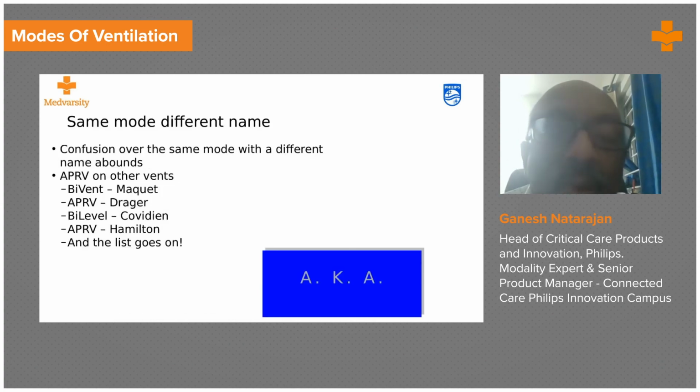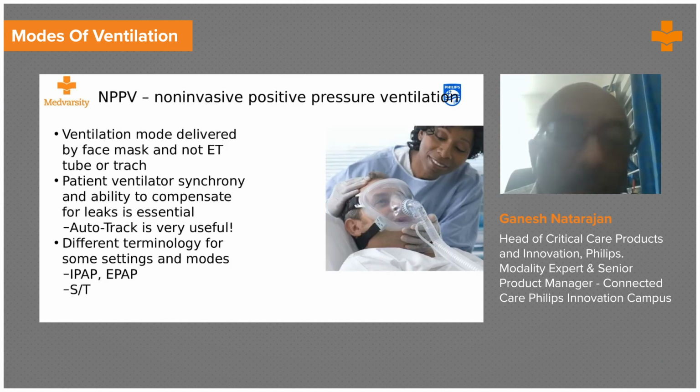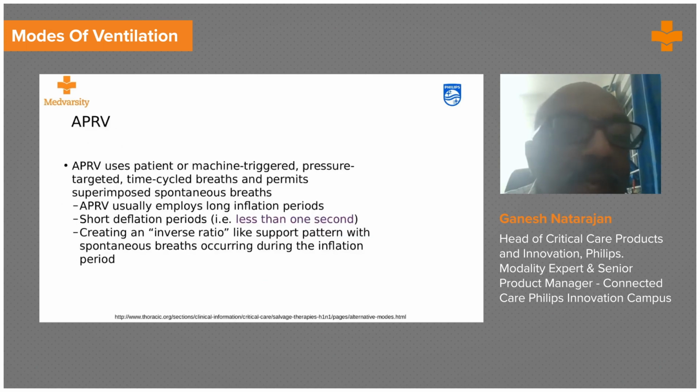Let's look at the graph; it is in the appendix. I'm sorry about that. But if you see the graph, you will see a long inspiratory phase followed by a very short expiratory phase. So there is an explosive release of gas. So it also helps you in washing out CO2. So it's technically a bilevel positive airway pressure with a reversed ratio or an inverse ratio.